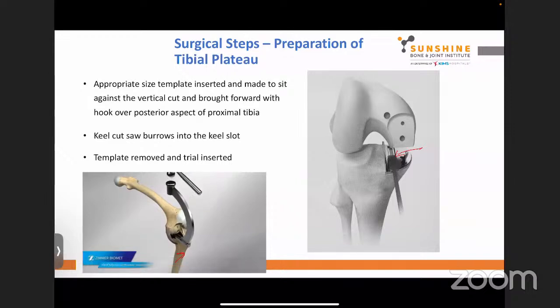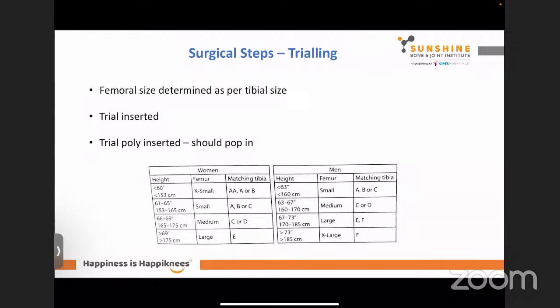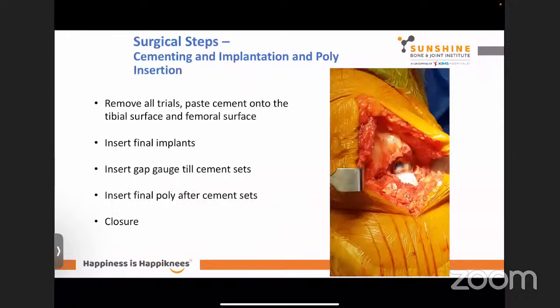And then you put in your femoral trial as well. So femoral size is determined as per the tibial size. The trial is inserted and the trial poly is inserted. It should pop in without too much force. Now remember, in that mobile bearing, you should be neither too tight nor too loose. If you're too loose, your poly can spin out. If you're too tight, you can put undue pressure in the lateral compartment. So once you're done, put in the cement and implantation, remove all the trials, paste the cement onto the tibial surface, insert your implants, put your gap gauge until the cement sets, and put your final poly and close.